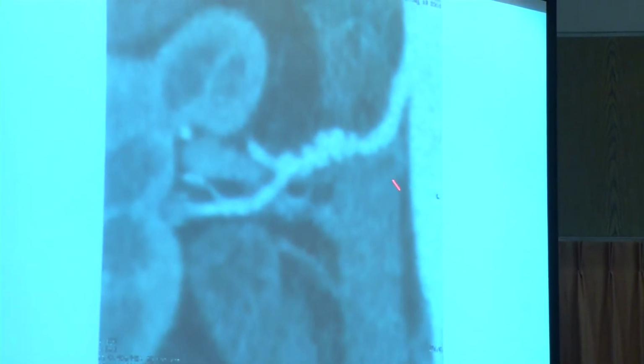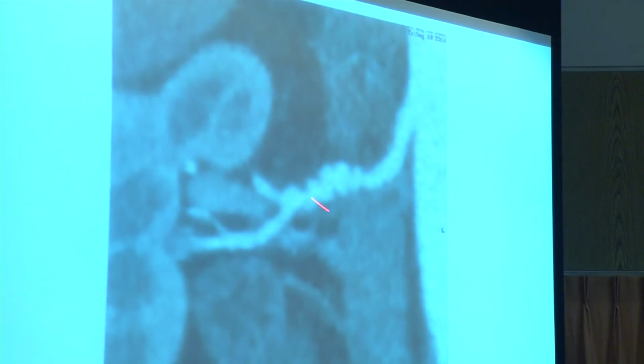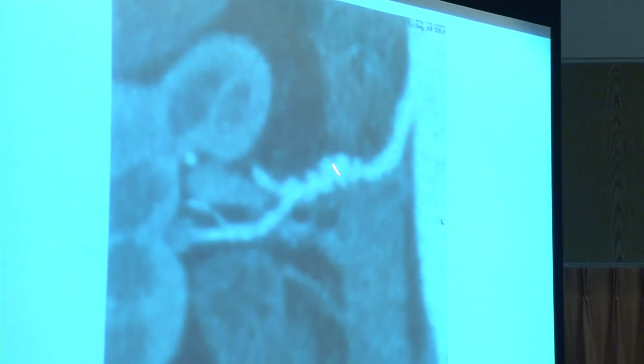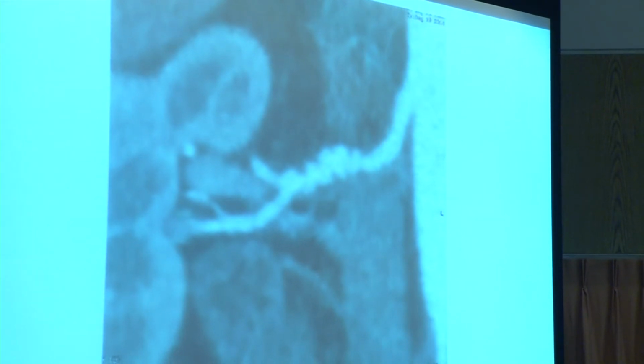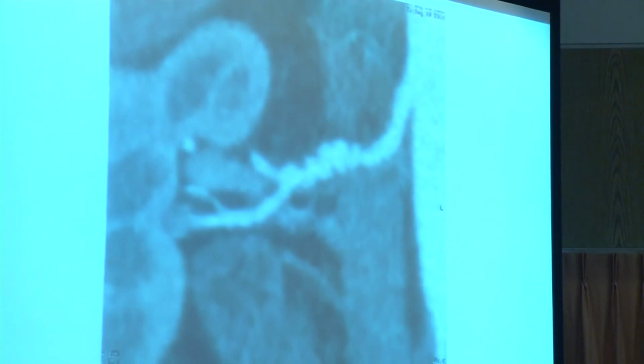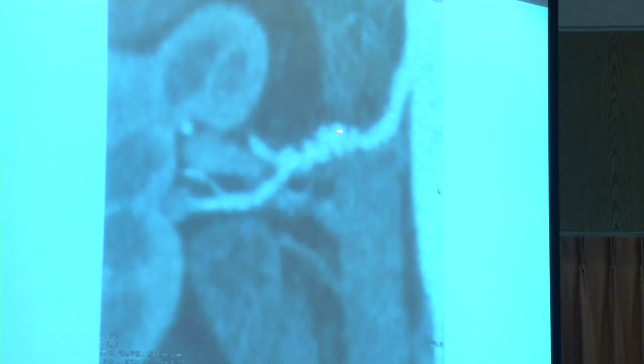This is one just from the other day. This is a young person who had poorly controlled hypertension, and this corkscrew appearance of the kidney is classic fibromuscular dysplasia. And this patient actually had a Doppler ultrasound which showed an elevated velocity, but the Doppler tells you there's a stenosis there, but it doesn't tell you the why, which was that there was FMD there.